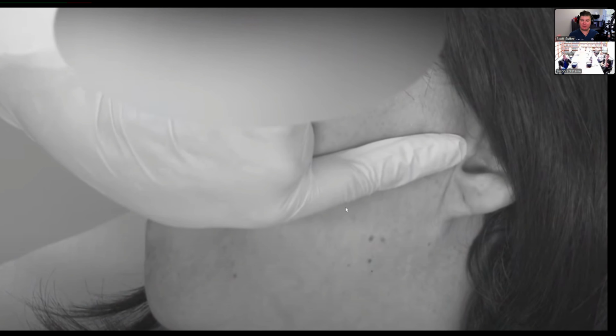So on somebody like me who's big, you tend to have to go through the whole hub. On someone much smaller, you may only have to go in an inch or inch and a half. But by putting your finger there, you can feel how far it is from the distance of where your injection, where the needle goes in, until where you actually give the anesthetic. Does that make sense? Were you guys taught this technique when you learned anesthesia? Hopefully? Yes. Okay, cool. Yeah, it really does help to figure out where you need to go, because you don't want to go past it. That's not going to be good for anybody.